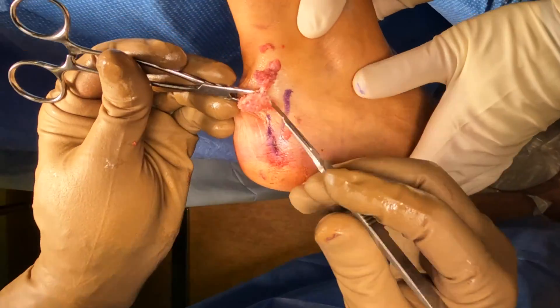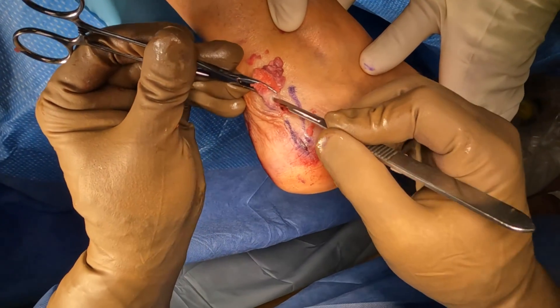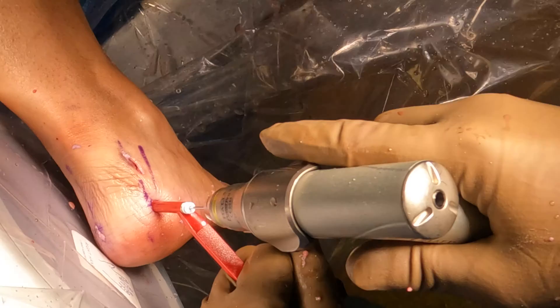We're using some pituitary rongeurs or even a hemostat to go in there and dissect out any of the large prominence that we've removed. These prominences, which are within the Achilles tendon or pushing on it, are what's causing the pain. And here you can see before and after, once we have removed it.